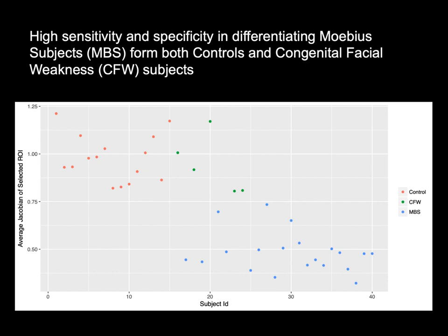I must say that the statistical properties of the Jacobians are already somewhat smoother than the other voxel-wise matrix, because it's generated from a smooth field. Because it's generated from a smooth field, yeah.